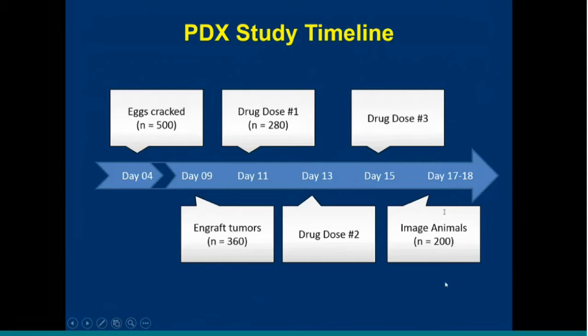So this is quite an involved scan at this point. If we factor in about 5 minutes for a volumetric scan and say, 10 minutes for a contrast enhanced scan just to coordinate the injection and then actually getting the cine loops here, you're looking at a pretty long scan time in this case. So it usually does last until the morning of day 18. So just be prepared if you're planning on doing a study of this magnitude that your scan is going to be a little bit arduous there.